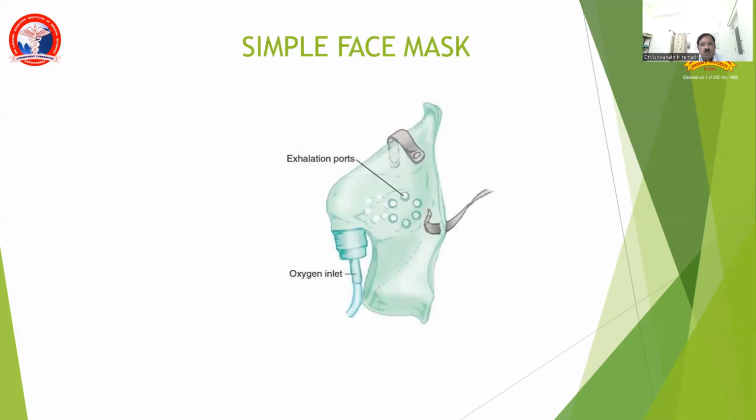Then you can use simple face mask. Additional oxygen will be supplemented to the oxygen inlet which comes from the oxygen source, and the patient can entrain the air through the ports, and exhalation happens through the holes that are present for the mask.